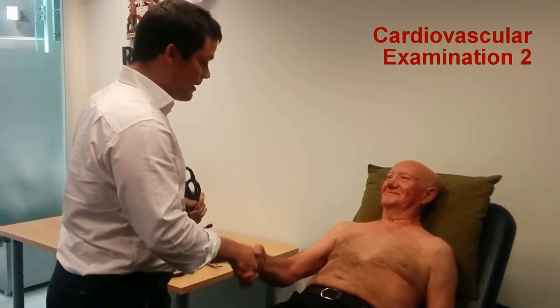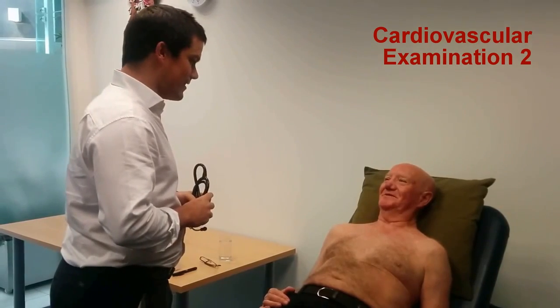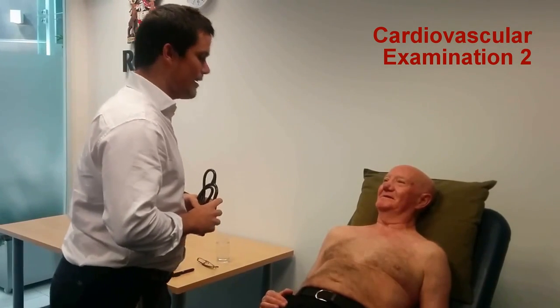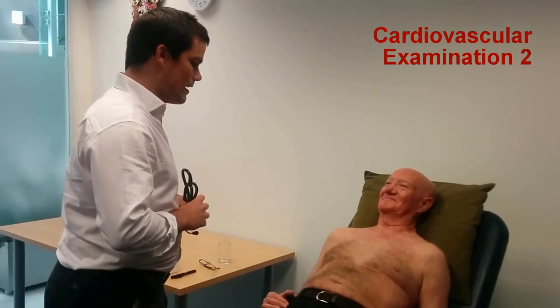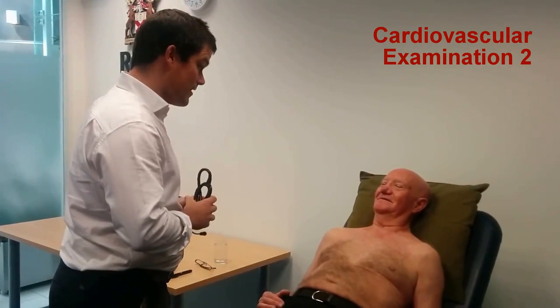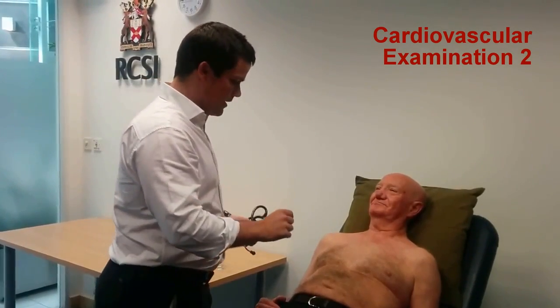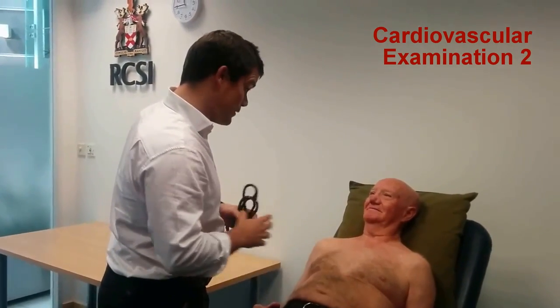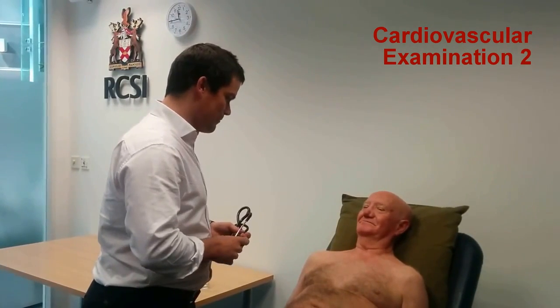Hello, my name is Mark Murphy, I'm one of the GPs in the Department of General Practice here. What's your name? Bob. And your surname? Bob Smith. I've been asked to listen to your heart. Is that okay? So I'll put the stethoscope on. I'll also need to roll you onto the left side at one point. Is that okay? If there's any problems at all, just let me know.